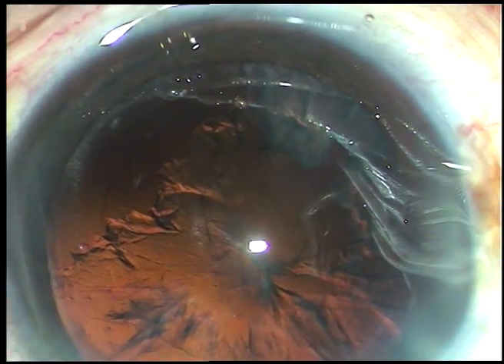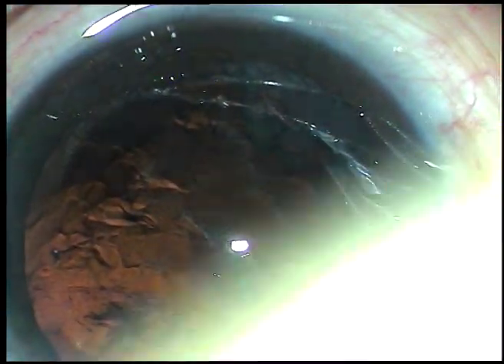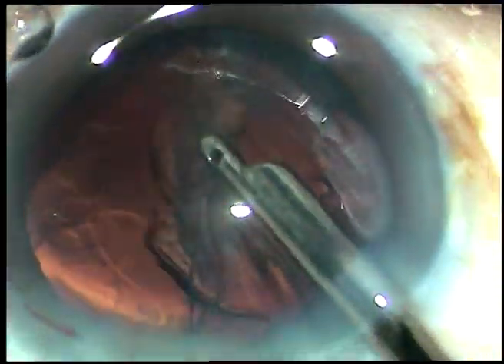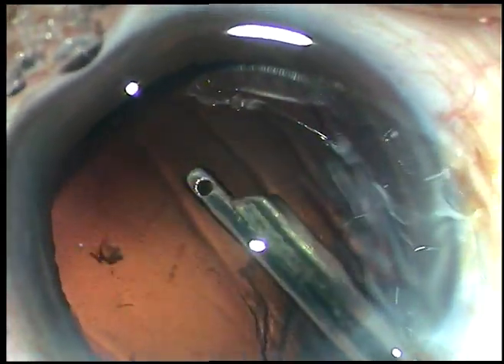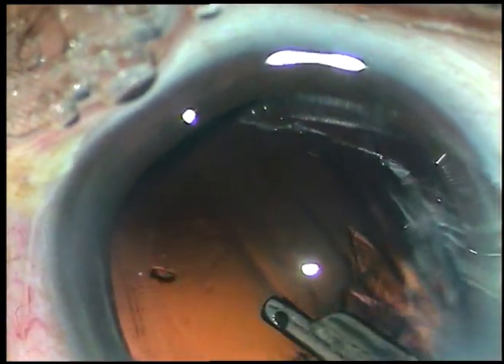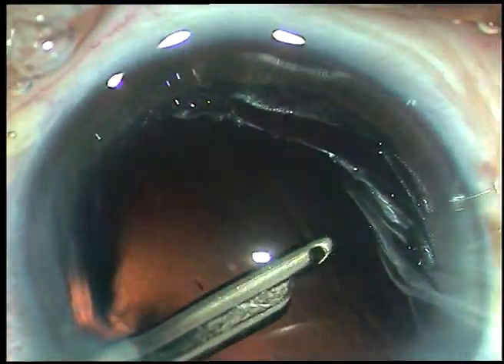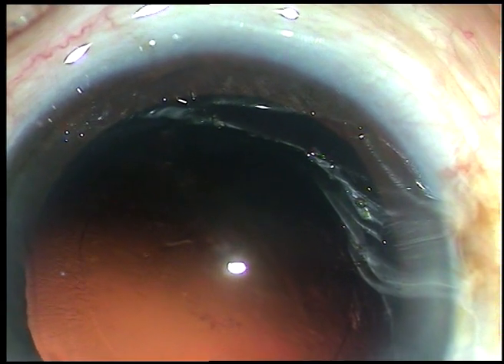Now, cortical cleanup is to be done. Since there is only one side port, you can use a coaxial irrigation-aspiration system, or this very simple instrument — a 23-gauge Simcoe cannula. The side port is 90 degrees away from the main incision, and the astigmatism induced by the main incision is reduced to some extent by the side port incision.